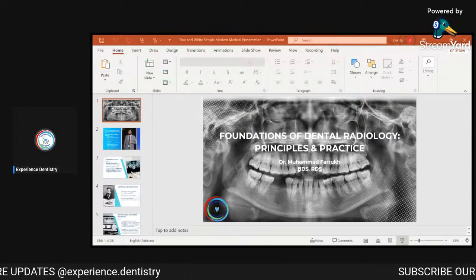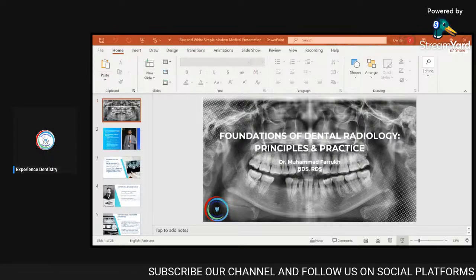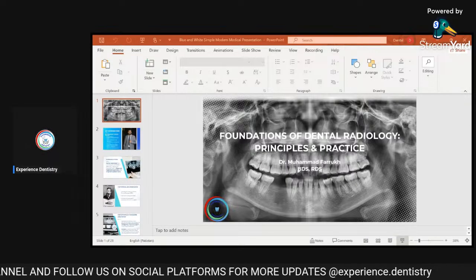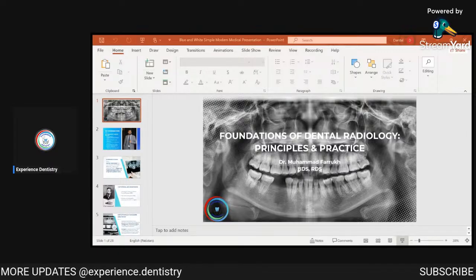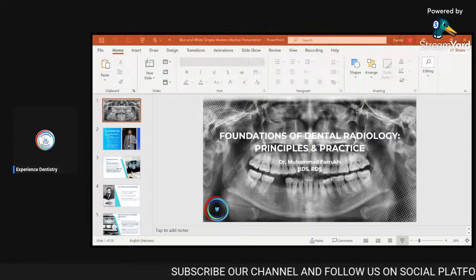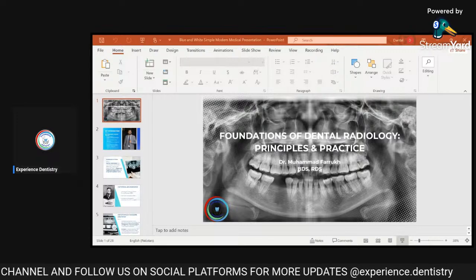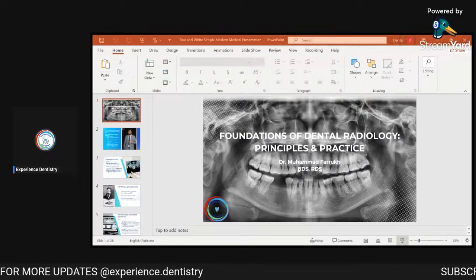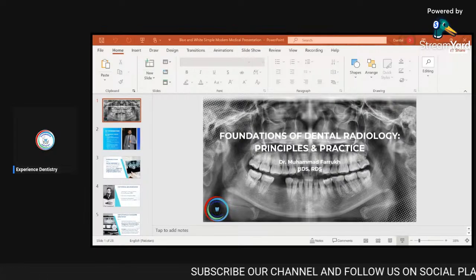Okay. Then you have periodontal disease assessment. How do you do a periodontal disease assessment? Basically, you see the interdental bone, how much the interdental bone has been eroded, or whether there is bone loss there. In this radiograph, you can see there is both vertical as well as horizontal bone loss, and these are basically the black triangles. You can see a bigger black triangle, which suggests that there is a lot of bone loss. I think this is a case of grade 3 or grade 4 mobility as well, because you can see there is very much bone loss in the premolar of this patient.